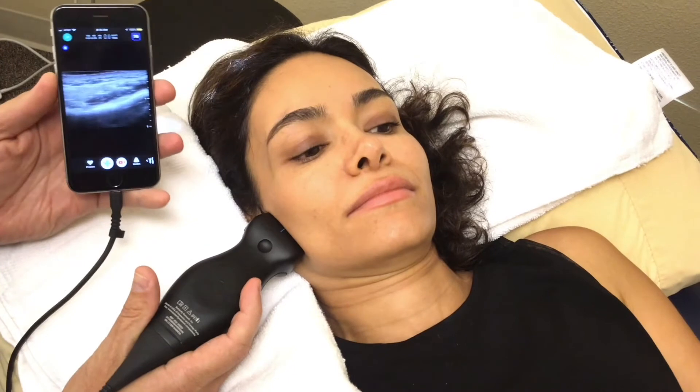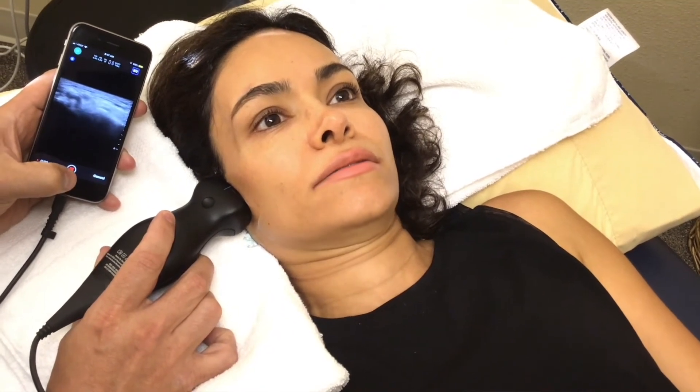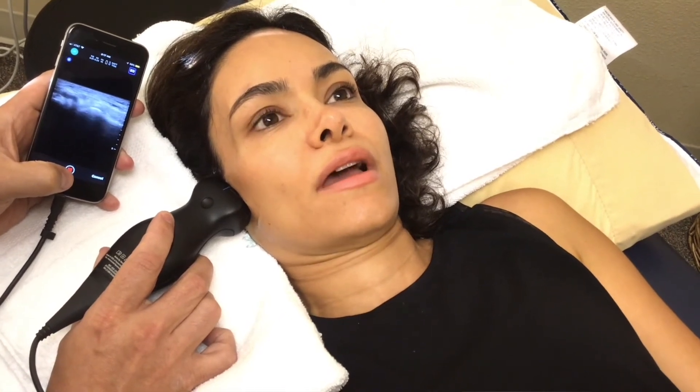Another imaging device starting to be used more — as more research is done — is diagnostic ultrasound. It connects to your phone with systems like this, and shows swelling, whether the cortex of the bone is intact, any bone spurring, and placement of the disc. We can also look at movement in real time. Expect to see more diagnostic ultrasound in the future — it can be done right in the clinic, is incredibly fast, and uses no radiation.